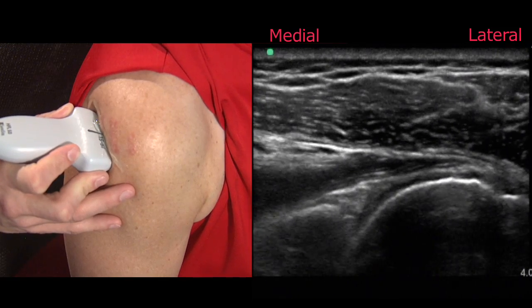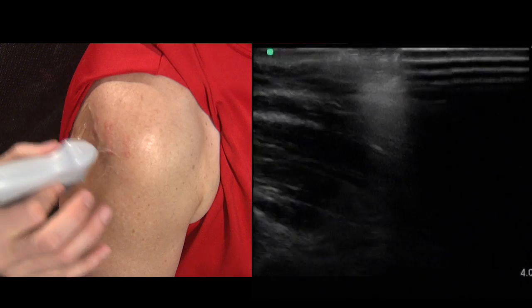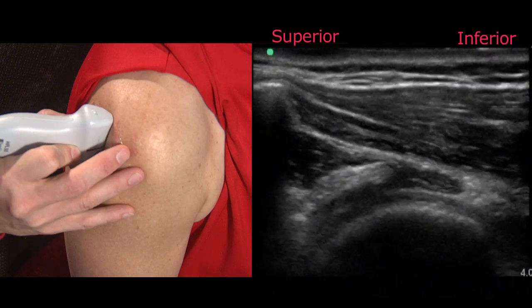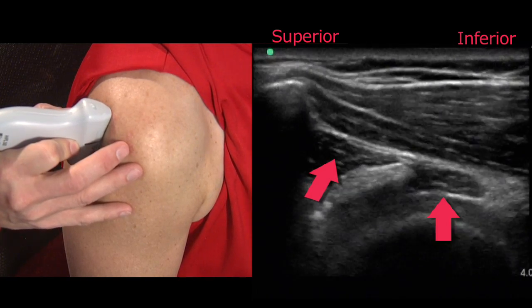Once we're satisfied with the long axis examination we'll orient the probe superiorly to appreciate the short axis view of the infraspinatus and the teres minor.